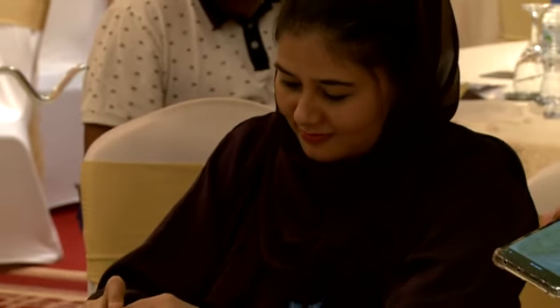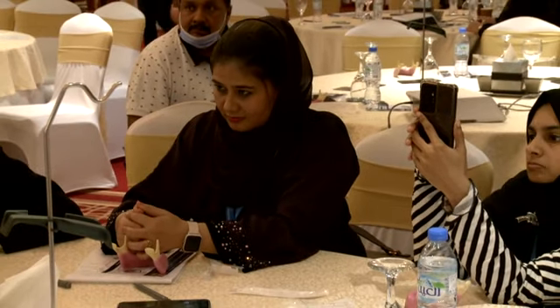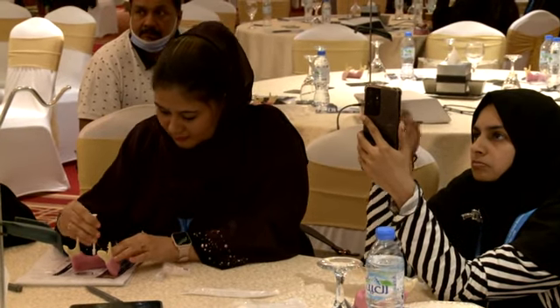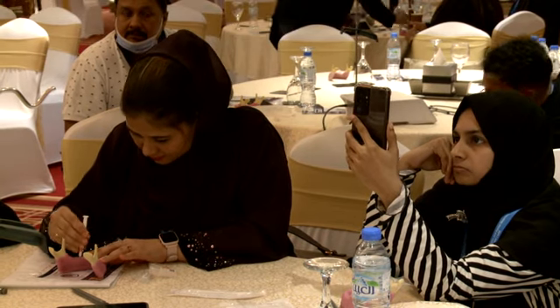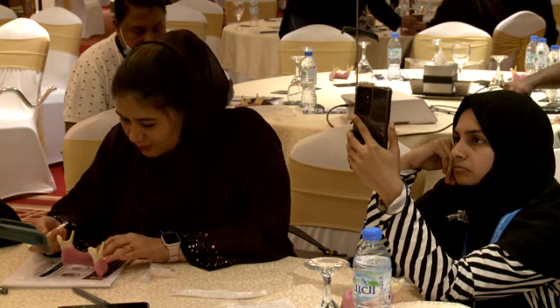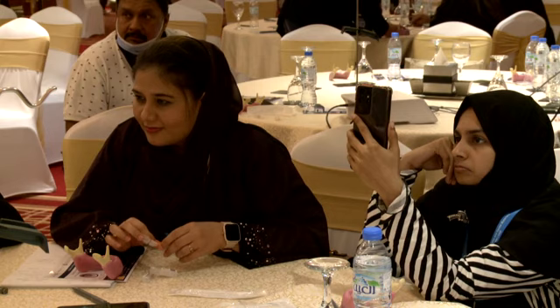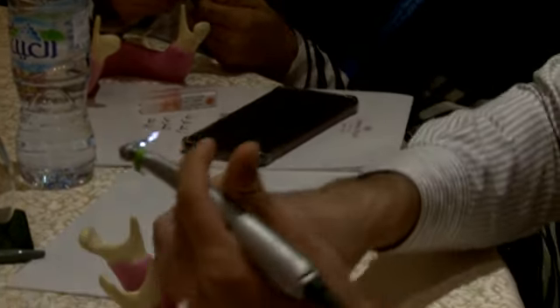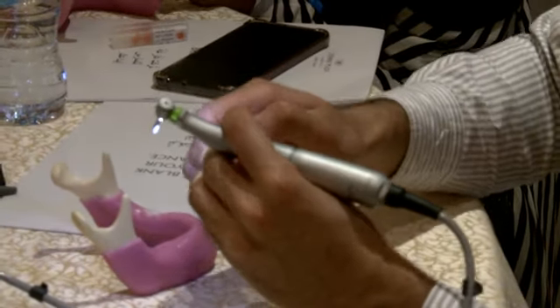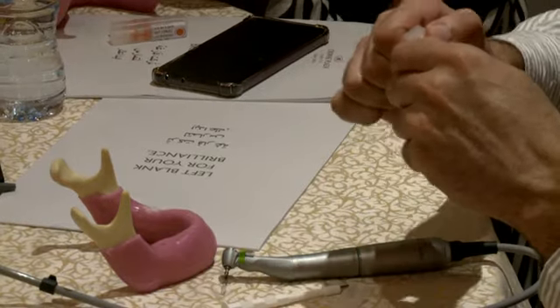And I'm going to run a small video to show how this will work, right? So while some of you are drilling, I'm going to show you this video. In an implant bed preparation, in an easier way, a freehand preparation, you raise your flap, and then for one drill protocol, sometimes if you feel that you want to do a mark, so this is an anterior case.